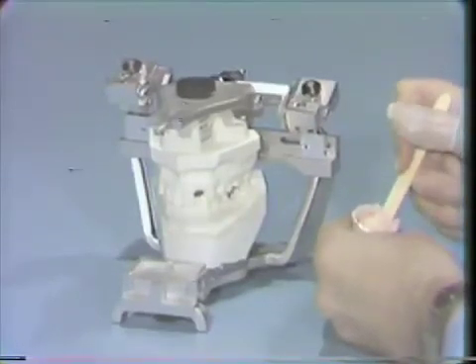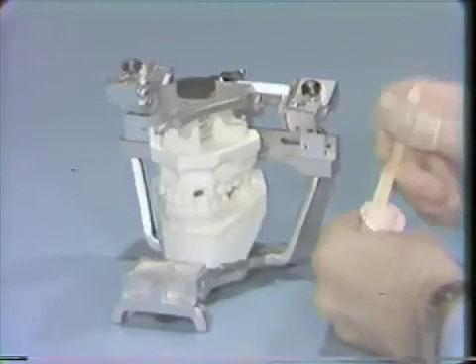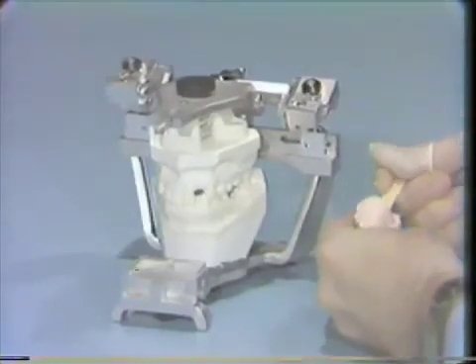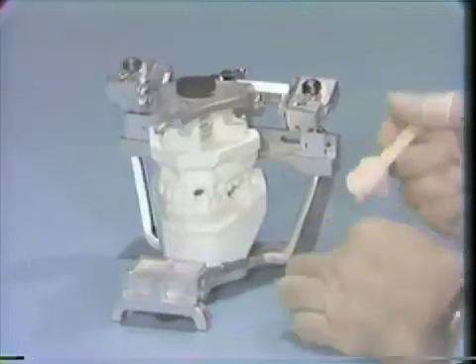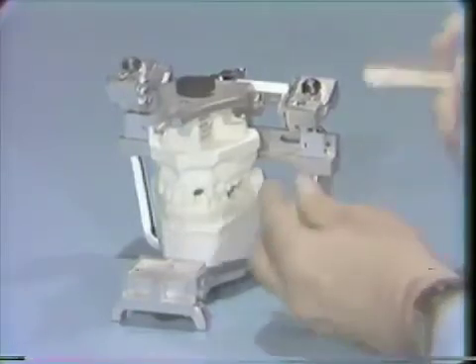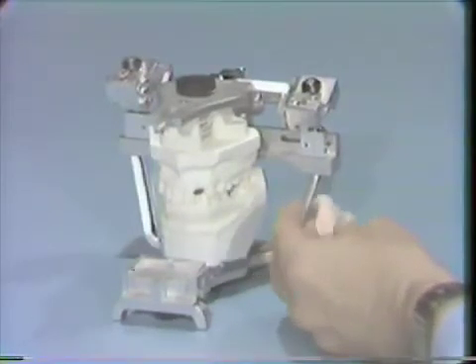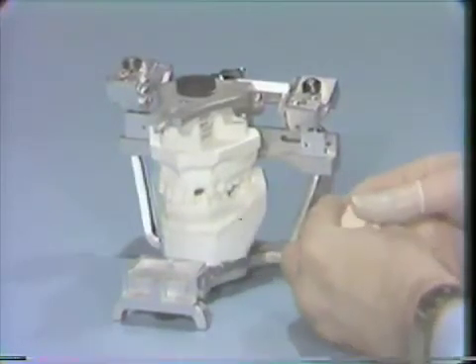In this particular instance, if the dentition had been stabilized in centric relation, obviously we would use that as our starting point, and we can handle our material now and make it up, as I say, into a rectangular shape.